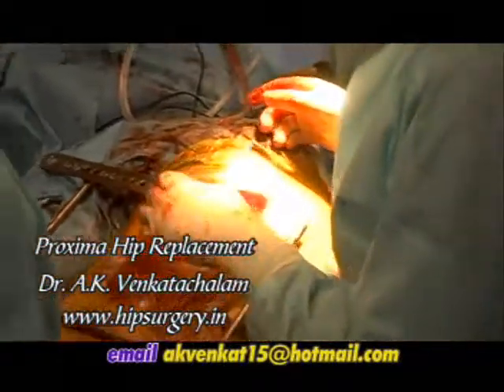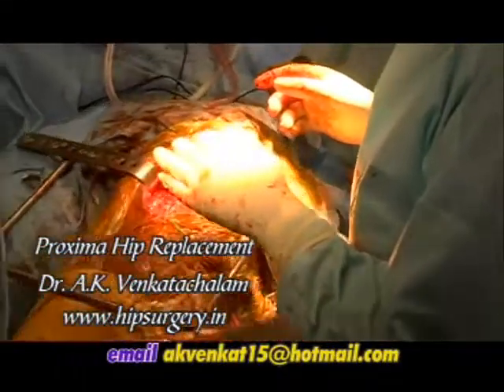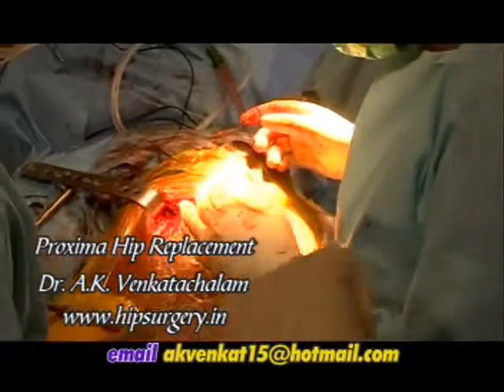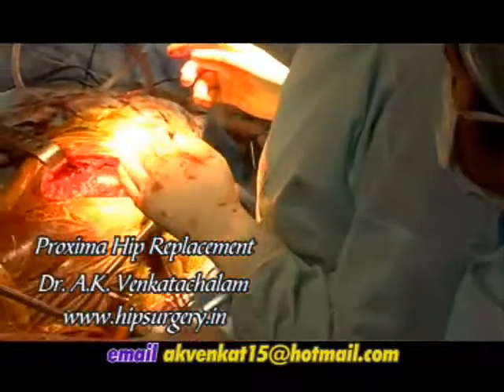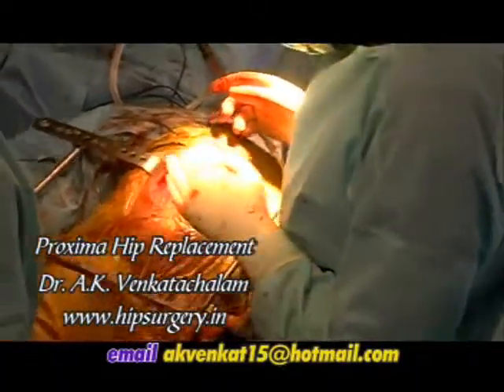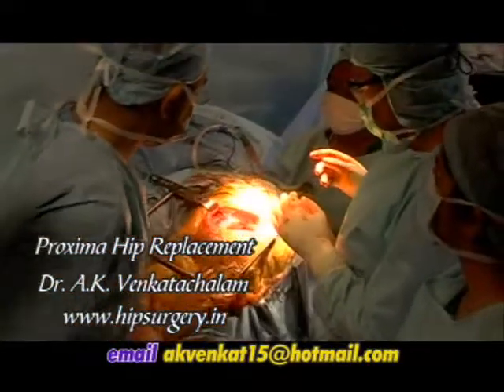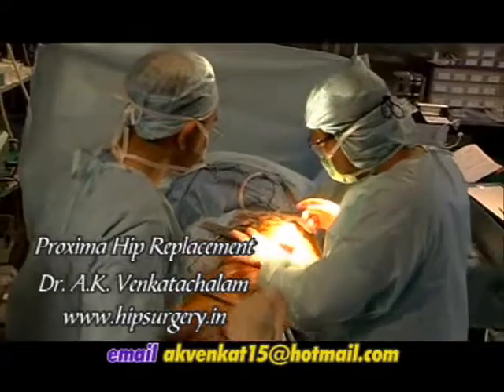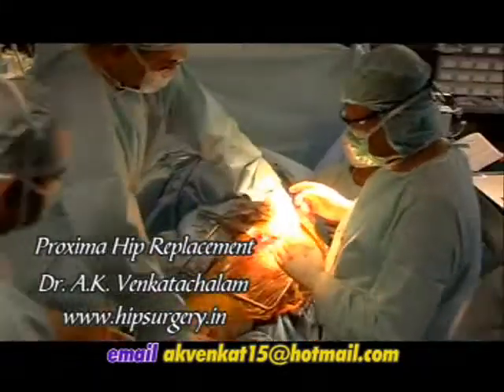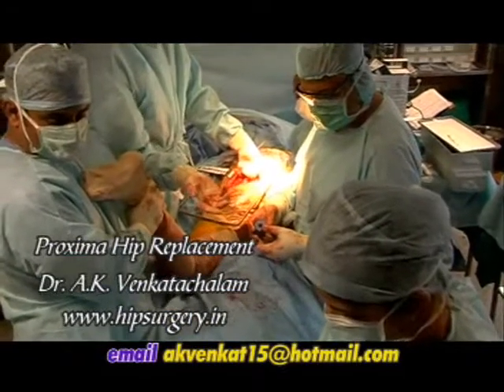The correct size of standard or high offset neck trial and modular head are selected to reproduce the patient's natural biomechanics. To optimize joint function and to increase stability, the largest diameter head possible should be selected. A trial reduction is performed and the hip assessed through a full range of movement to identify any instability or impingement.